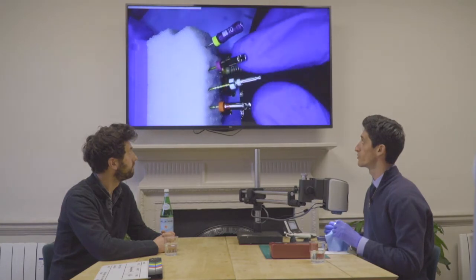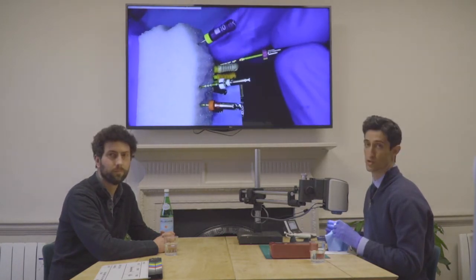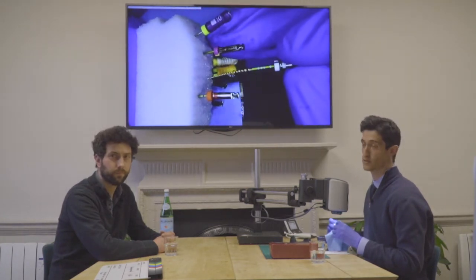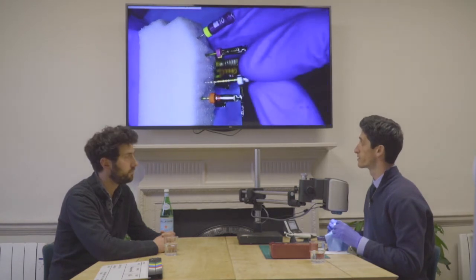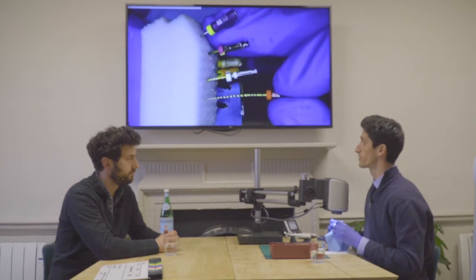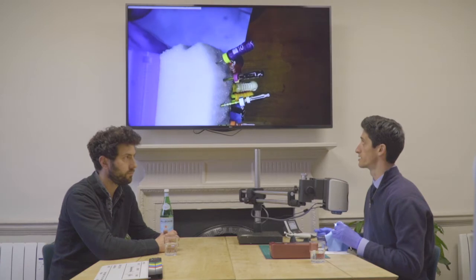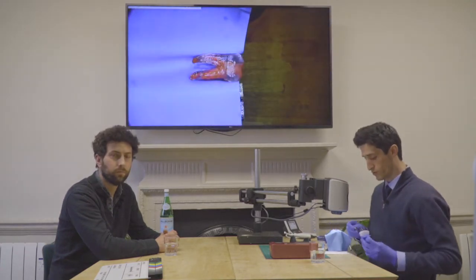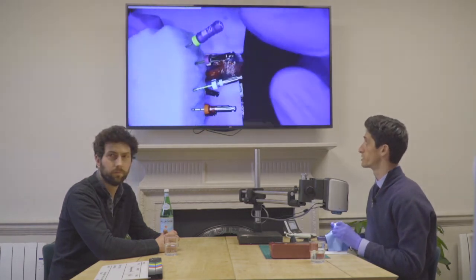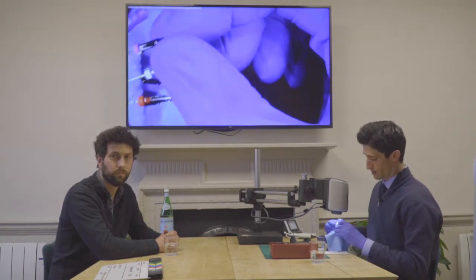We've got our size 10, then our purple True Anatomy shorty — the orifice modifier — and our glider file, which is the white one. Then we've got our finishing file, which is the red prime. Similar colors to what you're used to with WaveOne Gold and other systems. We're going to use this very simple treatment sequence: just these three nickel titanium files.